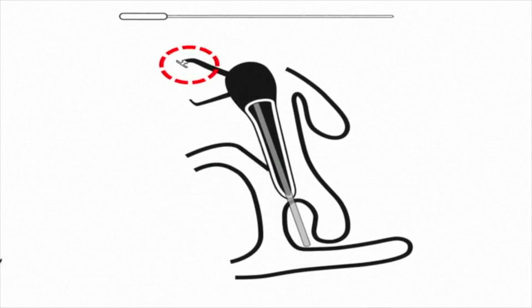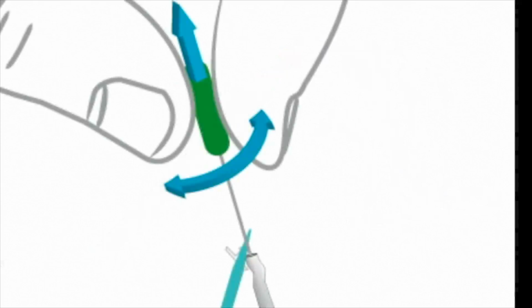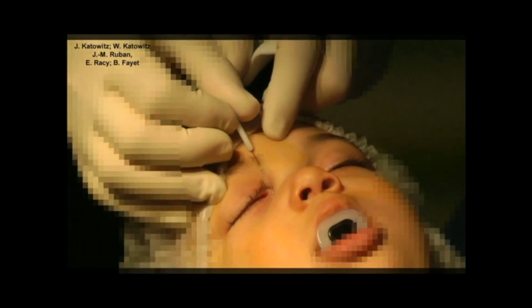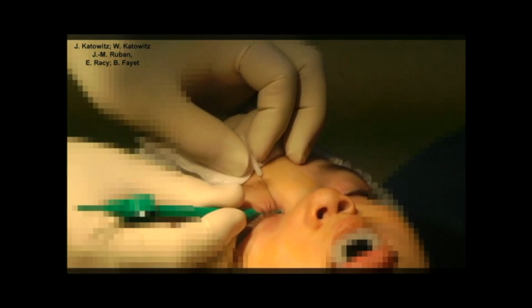The insertion guide must be removed very carefully. The fixation head should be kept in contact with the punctum by pressing the fixation head against the punctum using one end of the FCI dilating insertion instrument. Use of forceps should be avoided to prevent harming the delicate silicone sleeve. Rotating movements of the guide back and forth, like winding a watch, should be done very slowly with upward traction, millimeter by millimeter, while the guide and silicone sheath remain in the vertical axis of the nasolacrimal sac and duct.